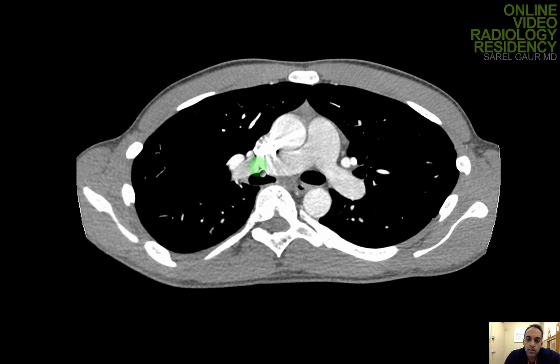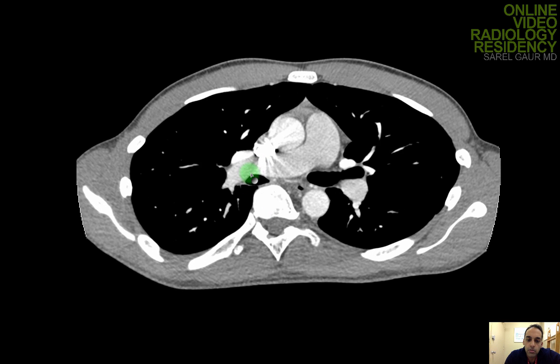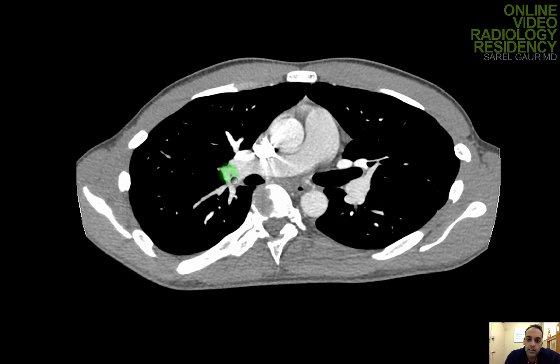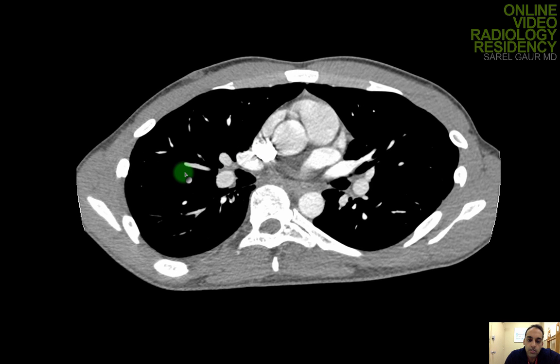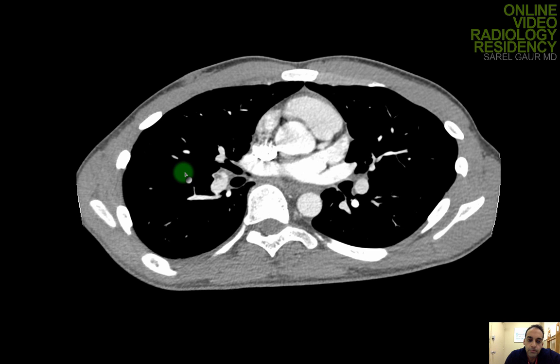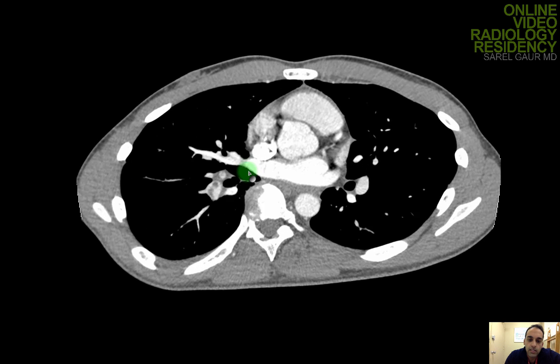I'm going to move on to the right middle lobe. I can see the right middle lobe pulmonary artery coming off in this region. I can see two branches, and I'm going to start following them and looking for any filling defect.